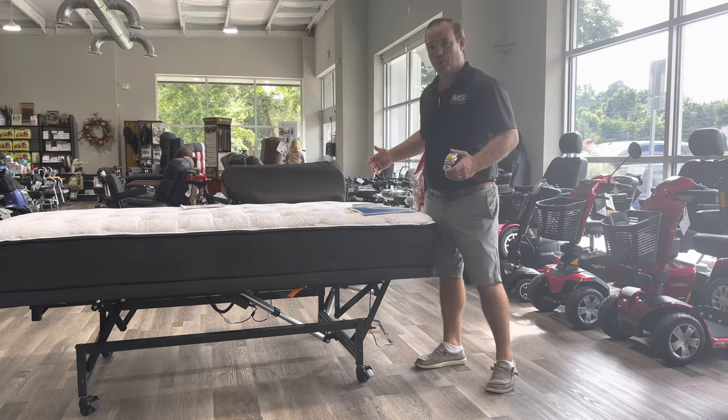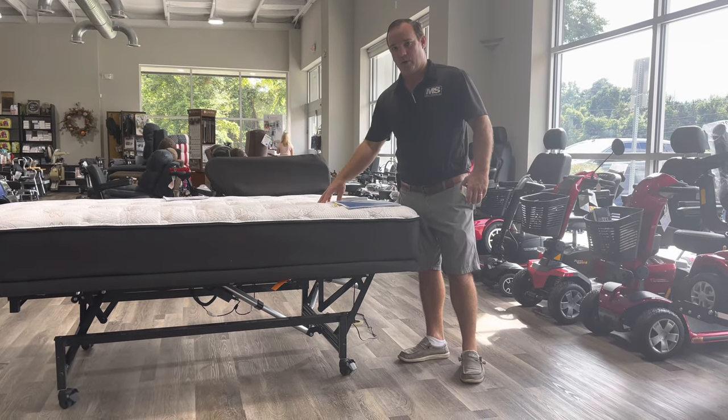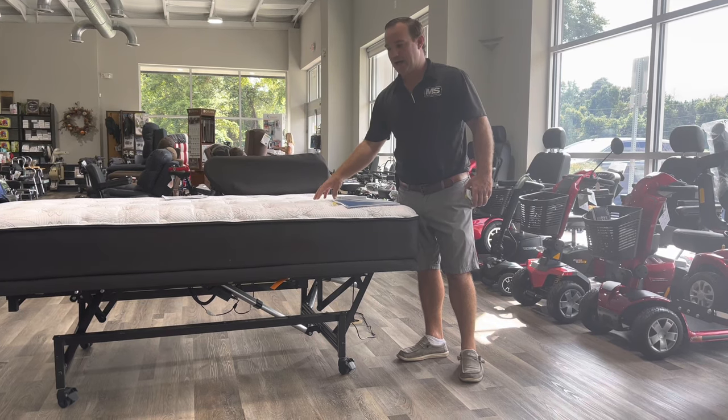With a high-low bed you can't put a headboard on it — you can put a headboard on the wall, but you can't attach one to the bed itself. Now with a premier bed or a value series bed you can, but we're talking about the high-low bed.